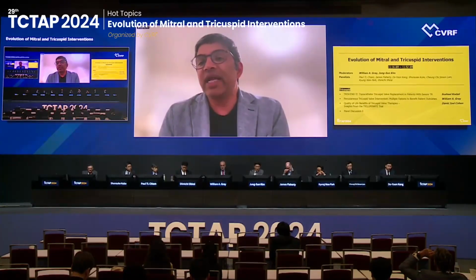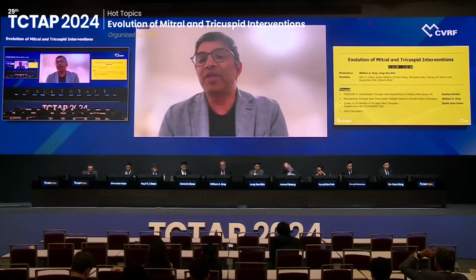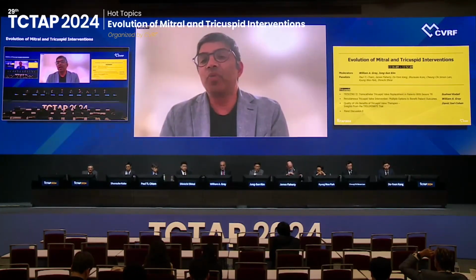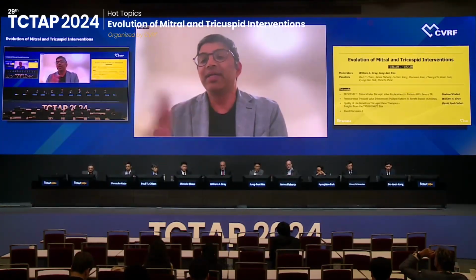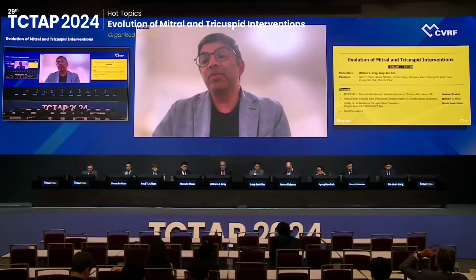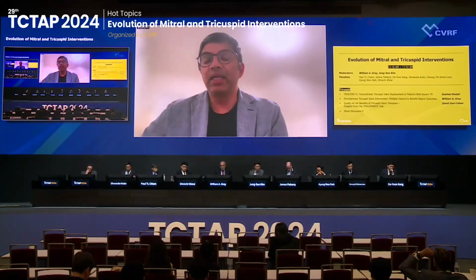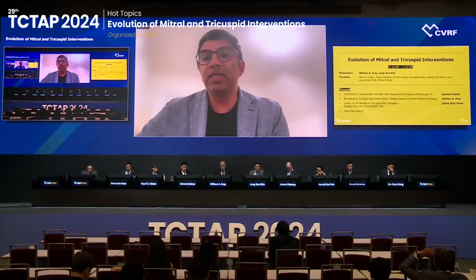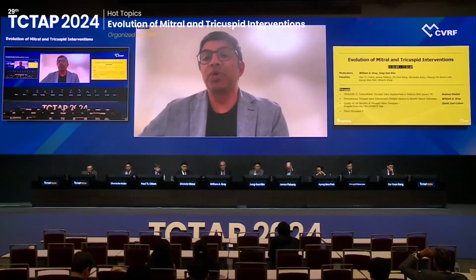But 30% of it is atrial functional TR. And I think we overestimated the mortality in that patient population. Their mortality rates at 1 year in atrial functional TR isn't going to be 30, 40%. So it's hard to show benefit if you only do a 1 year endpoint. So it's eliminating the sickest patients that may benefit and then not allowing longer term follow-up, I think, is going to hurt us. But I think what we see here, that the data suggests both TRILUMINATE and TRISCEND, eliminating TR is important to getting benefit. And the sicker the patients are, the more they're going to benefit.